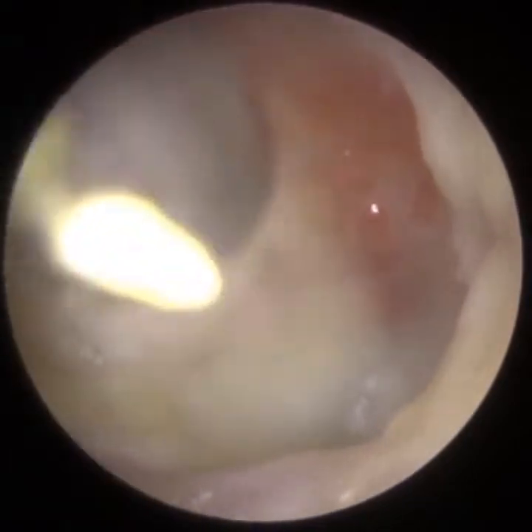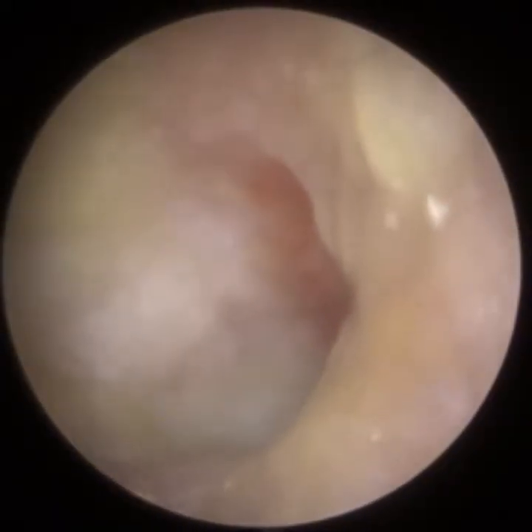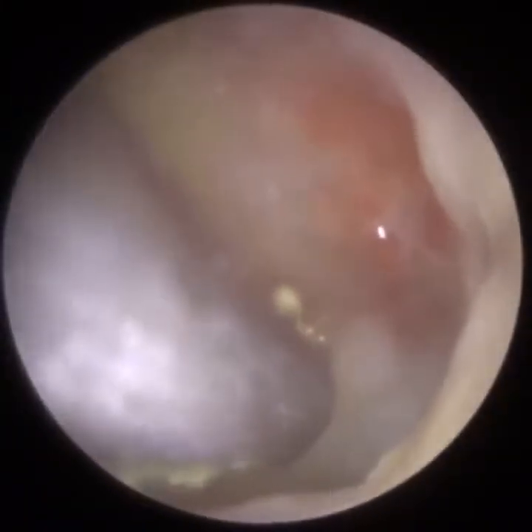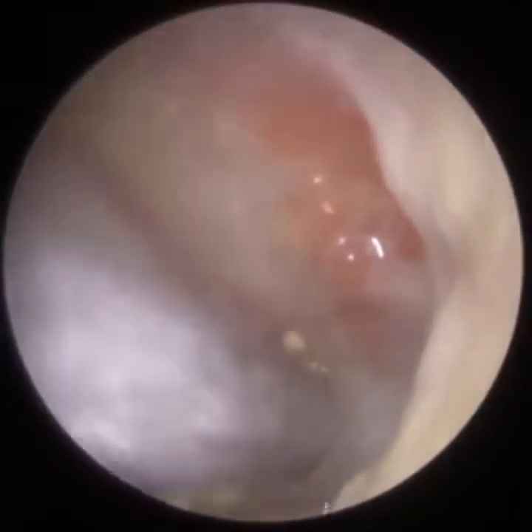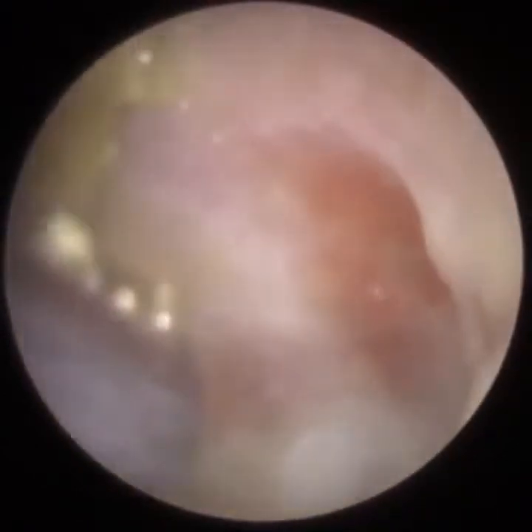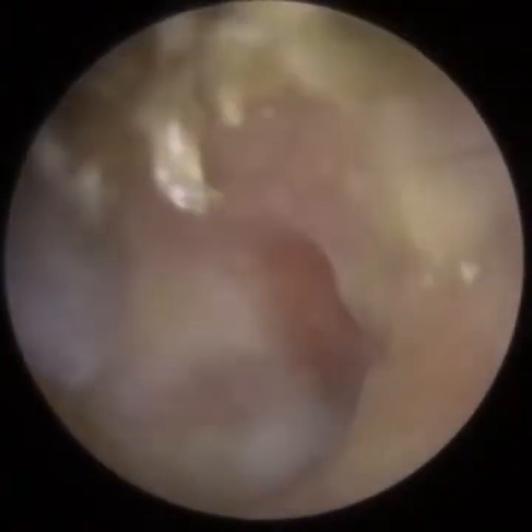This is not the first time the patient has had granulation tissue. They have been seen by ENT in the past, and I believe they attempted to cauterize this. Cauterizing is almost the burning of this connective tissue, and it kills the connective tissue formation. When it reheals, we hope that the granulation tissue doesn't occur. However, that's not the case in this particular patient. So the plan of action is just to clean the ear regularly. The patient attends every 4 or 5 months, and we just have to keep on top of it.